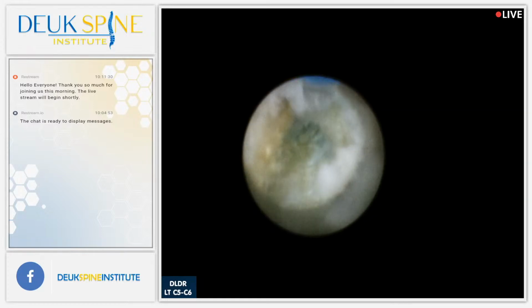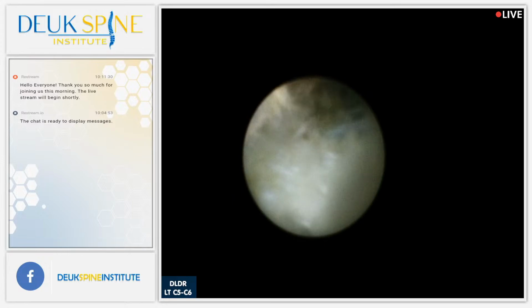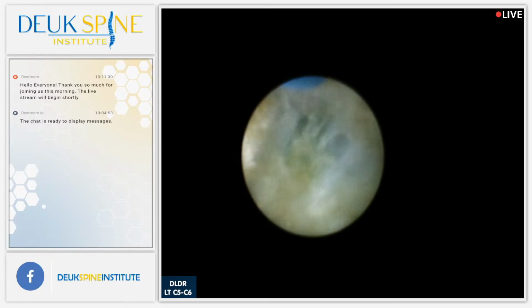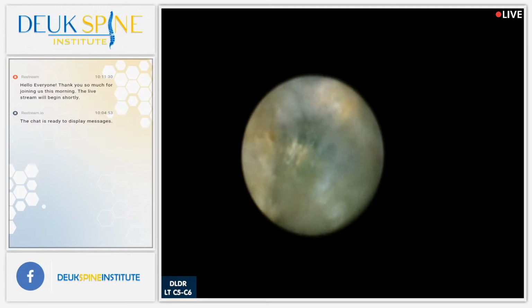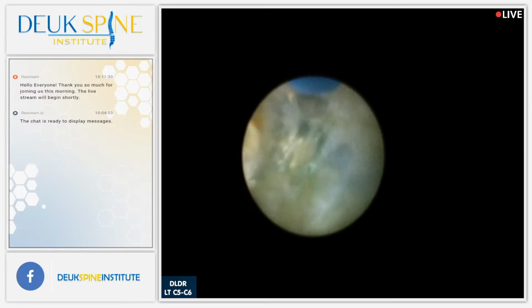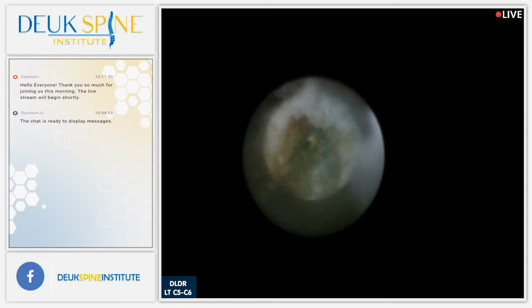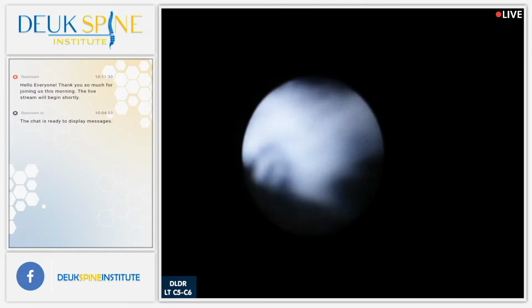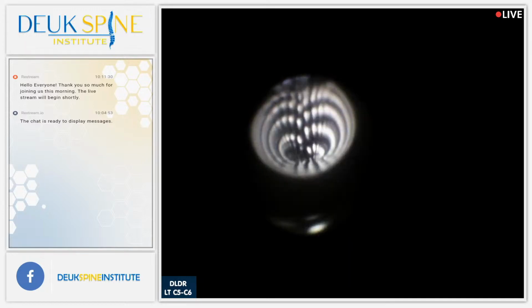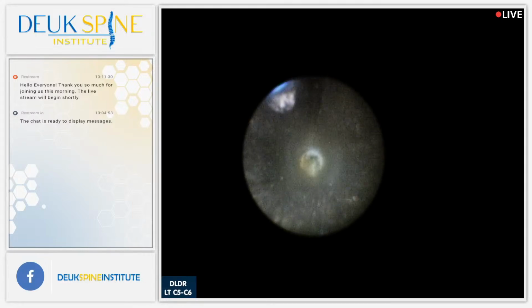So our patient is asleep. He is under gas anesthesia. Don't ask me whose gas it is. It's my gas. So what gas do we use for this? Sevoflurane. And why do you choose sevoflurane? Because of the speed and the fact that it's non-noxious to the lungs, non-irritating. Less of an emetogenic profile, doesn't cause as much nausea and vomiting after surgery. Speed of onset and speed of offset.